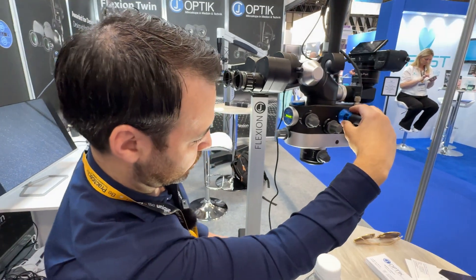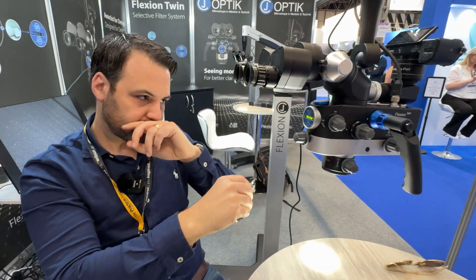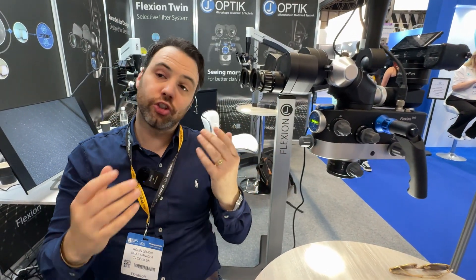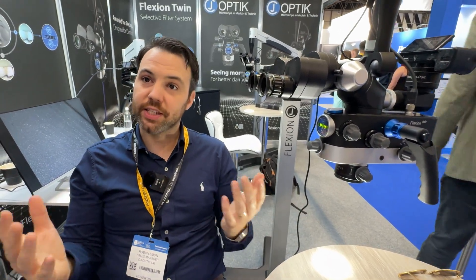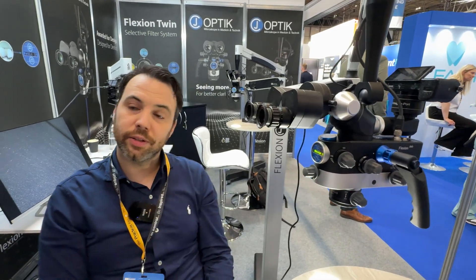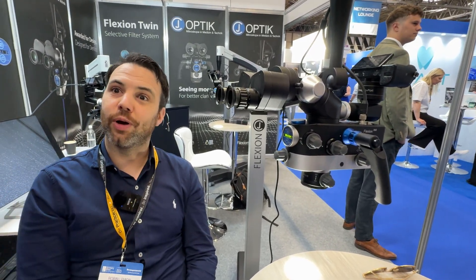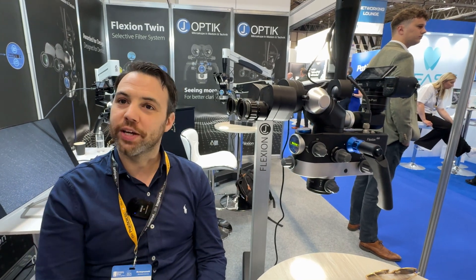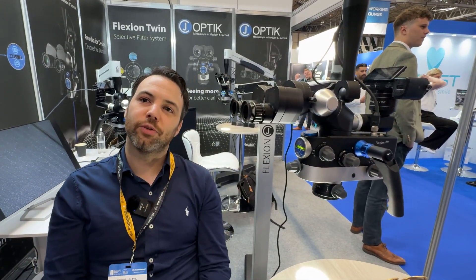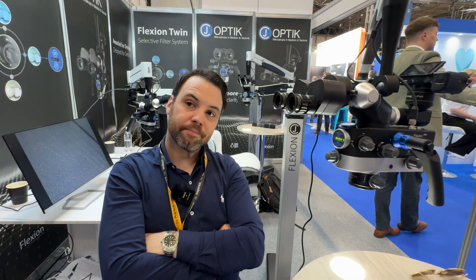Sorry, just a bit confused - what's the difference between the blue and the white? It's the same microscope, everything's the same on both scopes - you're just choosing fluorescence or a boost of white light. So if you're doing loads of general dentistry and a mix of endo and you want the top model, I'd say go for the blue because it gives you the breadth of options. If you're just smashing endo all day long, go for the white - because when would you use fluorescence on a root canal?